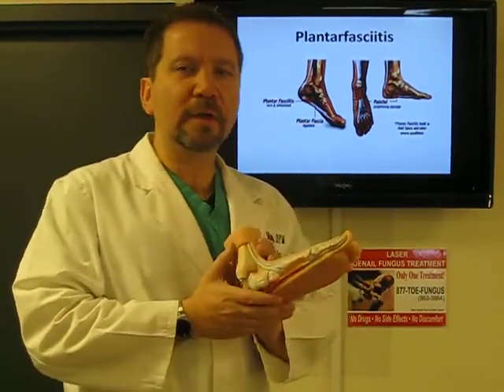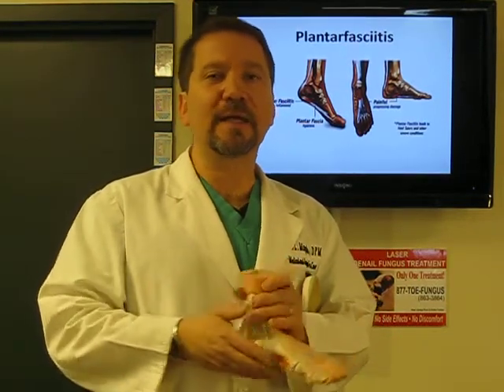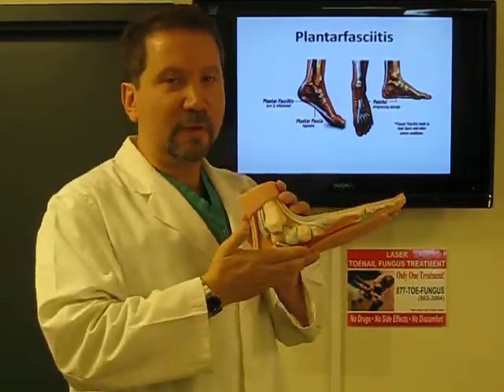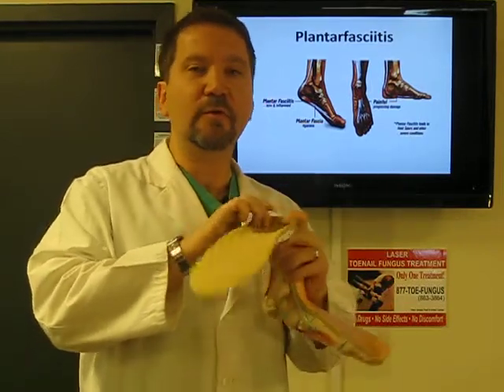You know, one of the questions I get asked a lot is regarding orthotics. What is an orthotic? How does it differ from an arch support? So let me show you. This is a relatively fallen arch. It's a flat foot. And for a treatment, many times we use what's called an orthotic.